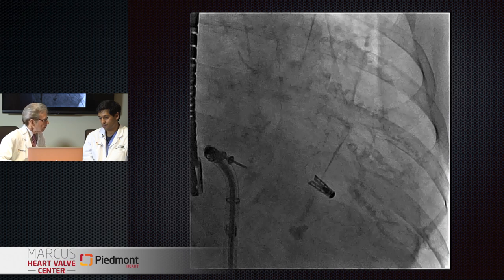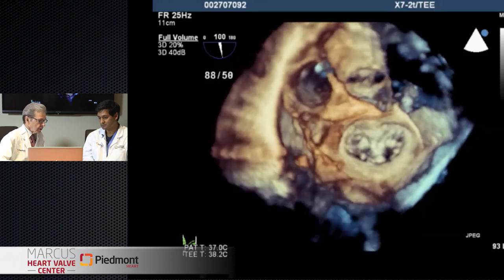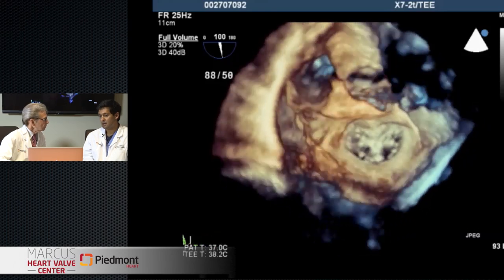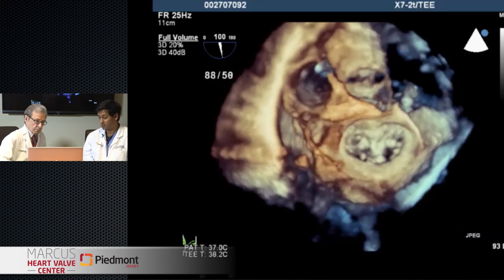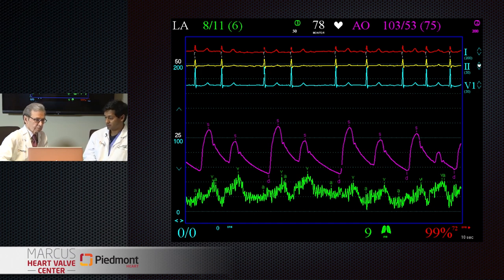The clip has been released. Looking from the atrial surface we see a beautiful double orifice - a nice double orifice - and at the end we had very mild MR. Looking at the hemodynamics now: we've dropped the mean pressure in the left atrium from the twenties down to the five-to-six range. This is a normal left atrial pressure. So we've basically fixed her. The residual MR was really mild.